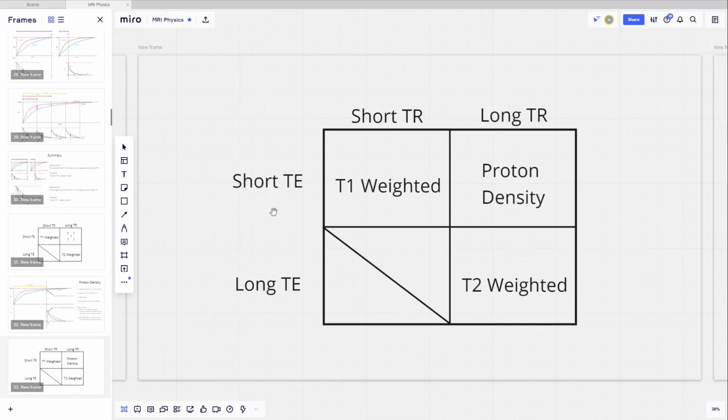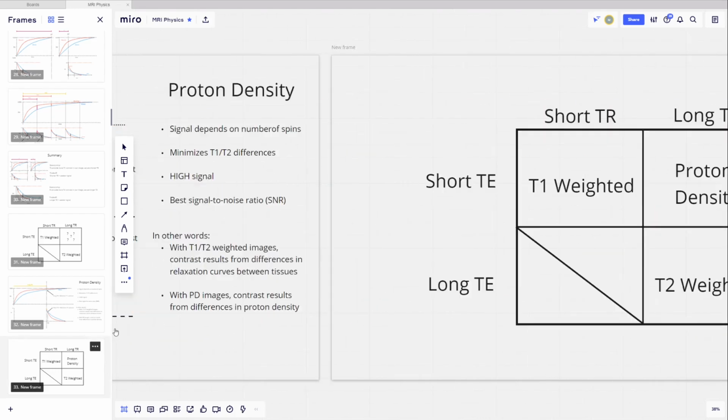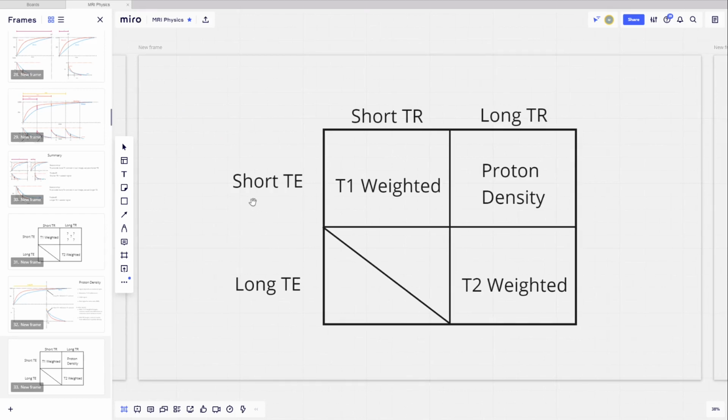And if we want to make a T1 weighted image, then we want to have a lot of T1, and we want to minimize the amount of T2 contrast. So we'd make our TE short, right? We want all of this showing up, and we don't really want this difference showing up, so we might measure our TE here, where there's less information about the difference in T2 being imparted. If you have a dial on your MRI scanner for TE and TR, you're going to set your TR to be short and your TE to be short, and that's going to give you a T1 weighted image.